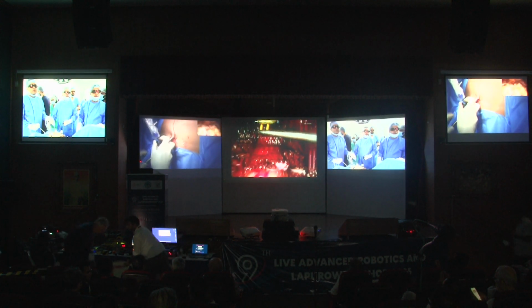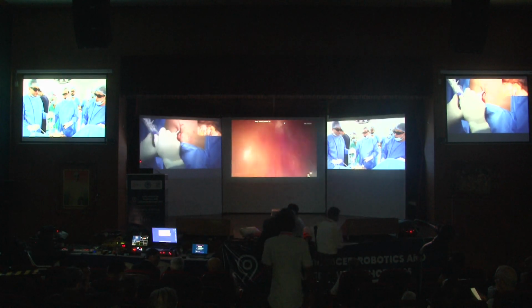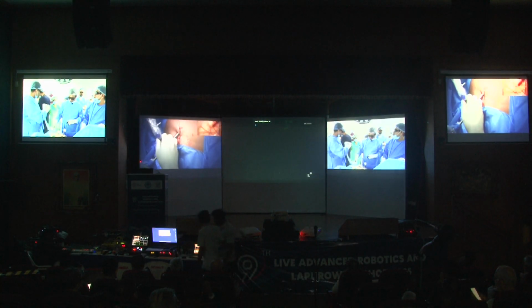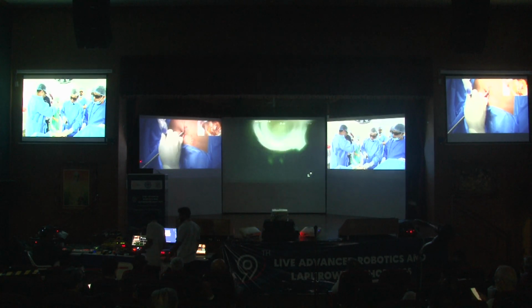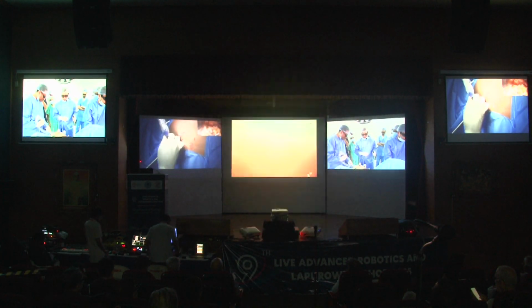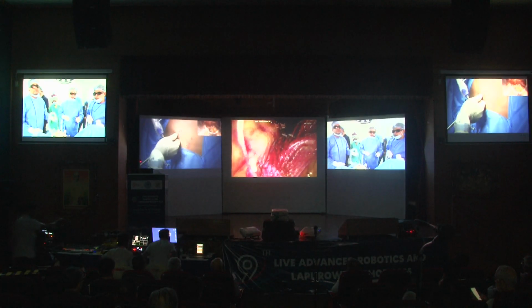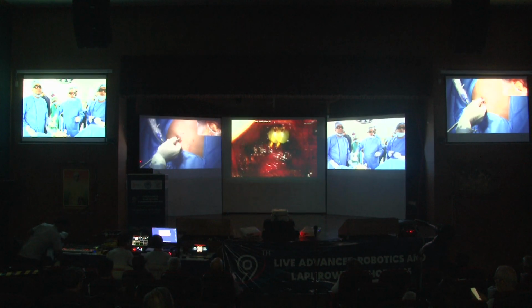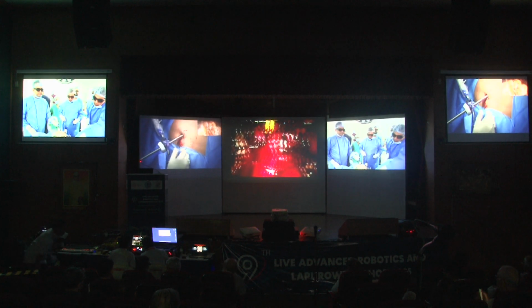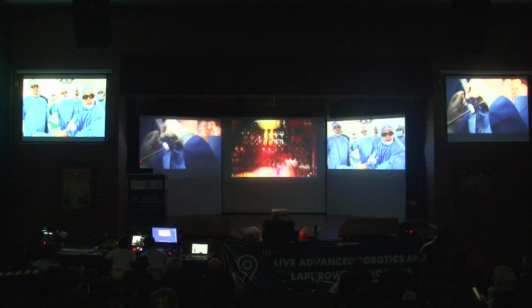More towards the apical portion. So we have done the lymph node dissection on the left side, and we are doing the right side. I'm just showing our template on the left side. Then you can continue. So this is the rectum. One person can just put a finger, and we can show you that we have preserved the perirectal tissue all around. Yes, we can see that.